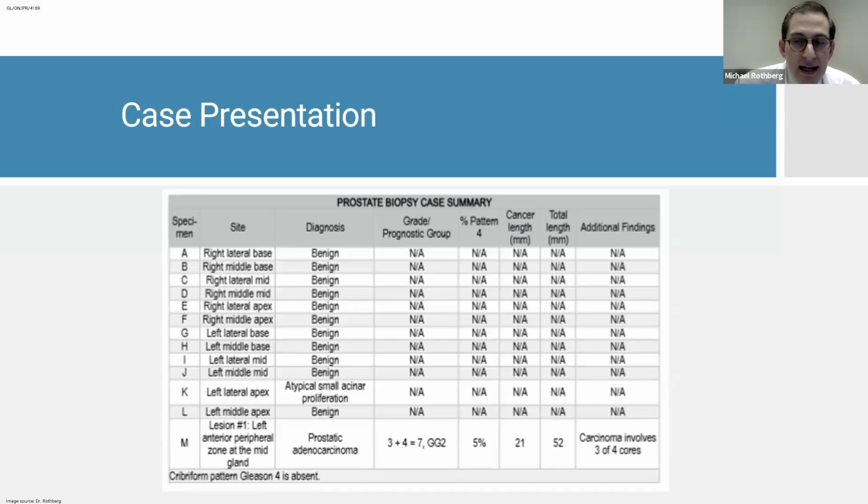So in total, this is a classic example of a really good candidate for focal therapy, specifically for IRE ablation. He has an anterior index lesion with a moderate amount of tumor volume. He has favorable baseline function and quality of life and strongly desires to maintain this. His disease progression occurred while he was on active surveillance, but based on imaging, still has what is apparently organ-confined disease. And given progression over the course of 1 year, he has concerns about remaining on surveillance, and he strongly desires avoiding whole gland approaches like radical prostatectomy or radiation therapy.